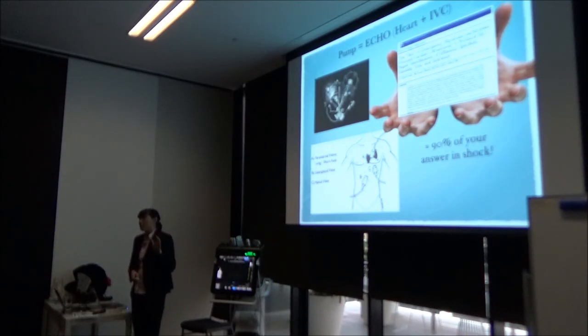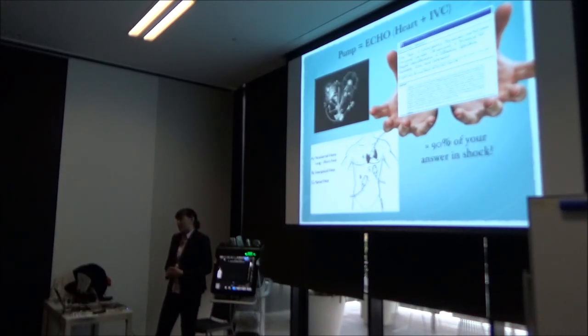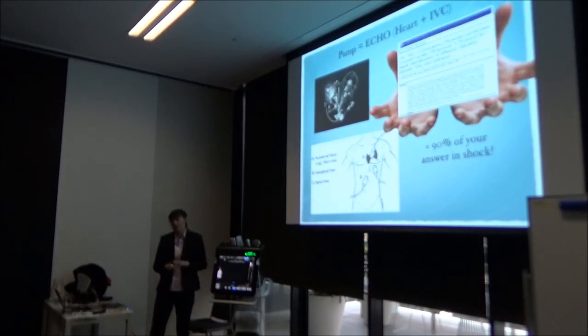And five, I include IVC always with my echoes. What is my preload? What is my entrance going into the heart? The heart probably will give you 90% of your answer in shock cases. And, you know, I'll go through it at the end, but we rarely go through the whole RUSH algorithm. We mainly stick with the pump and then the tank.